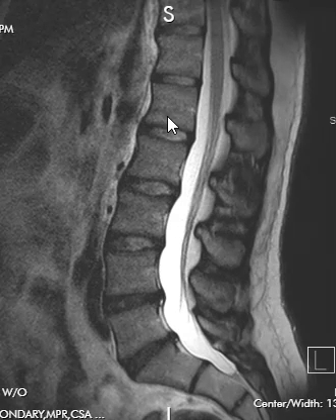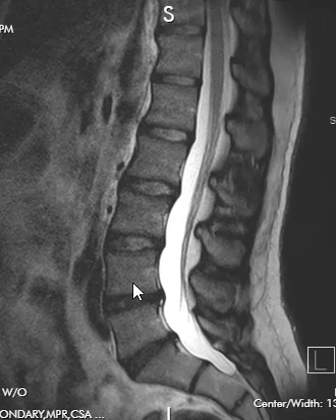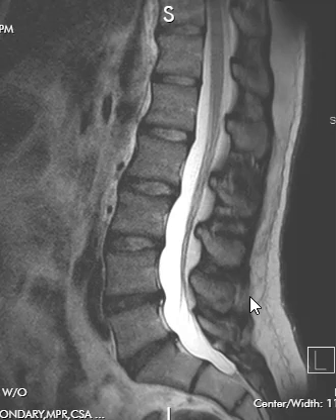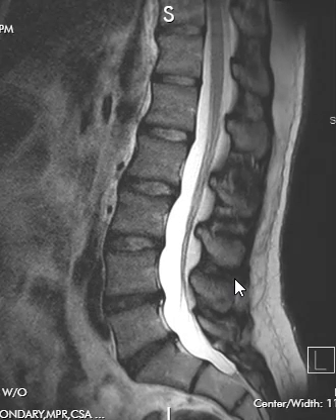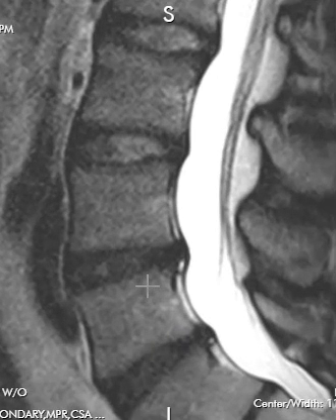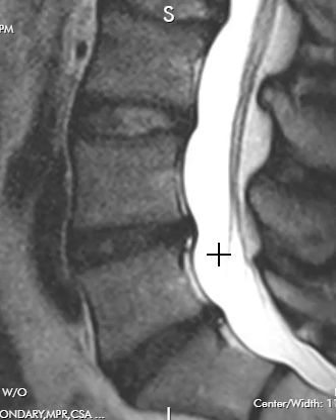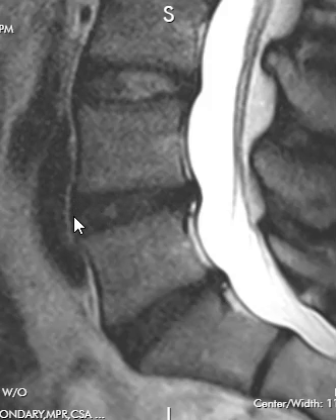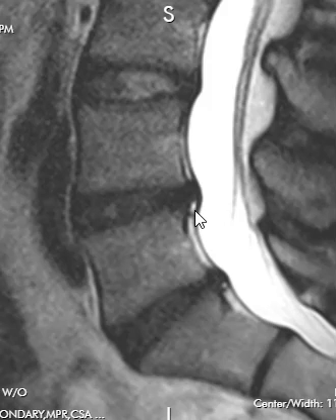Fluid is really white on this sequence, and discs should have a fair amount of fluid — they should be bright. So these are normal discs: bright, nice, and tall. These are all good except for the last two. See how dark that is? They've lost their water content — we call that disc desiccation. It's a sign of wear and tear or early degeneration. Both of those discs have little white areas associated with them called annular fissures. The annulus fibrosus holds the disc material in, and sometimes it can have a little tear that appears very bright.